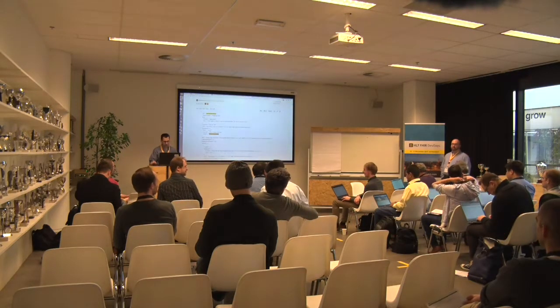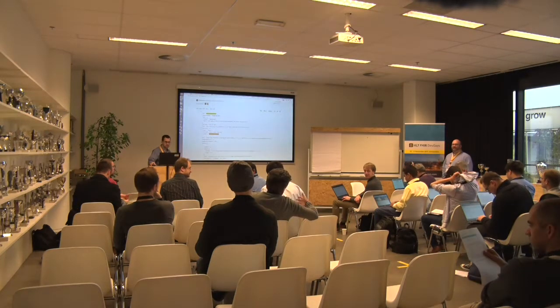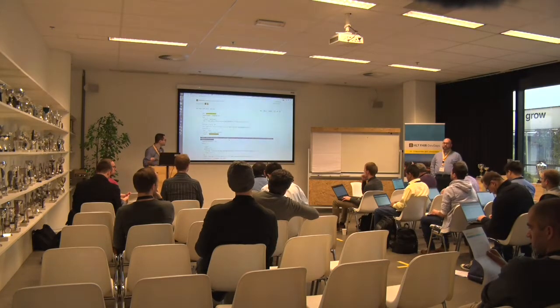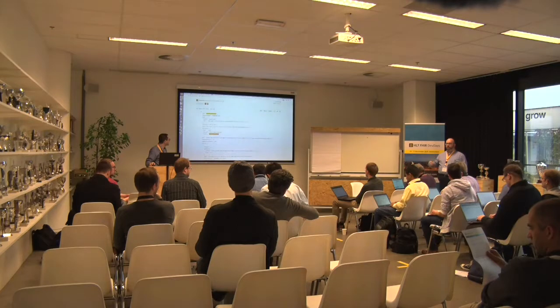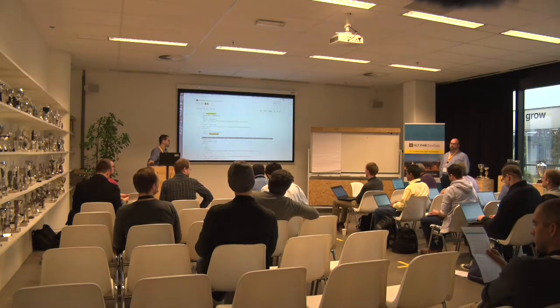People put OT kind in the same series as OT images, at the instance level. Yeah, you can have different object types in the same series, but the OT modality would apply to all those objects. So you could have reports and images in an OT series, but the whole series would have the OT as the modality, at least it's supposed to. Because if you don't, then that's a big trouble.